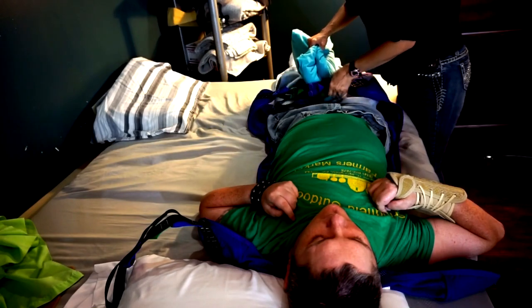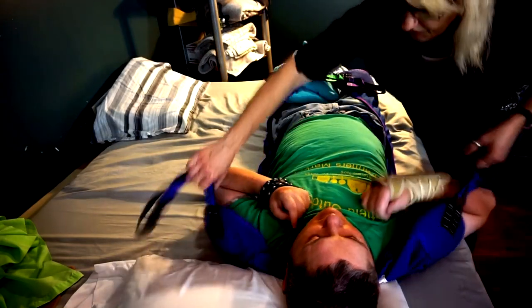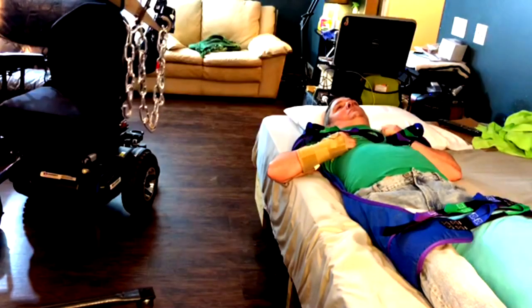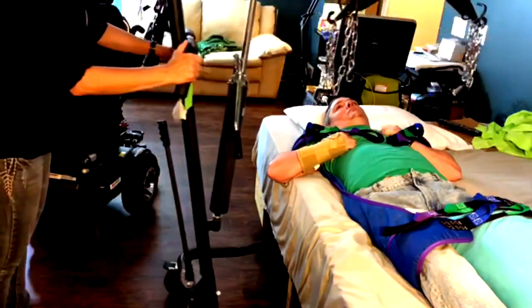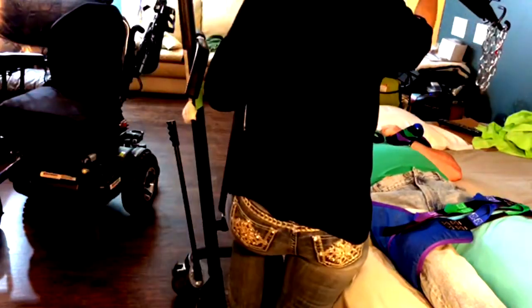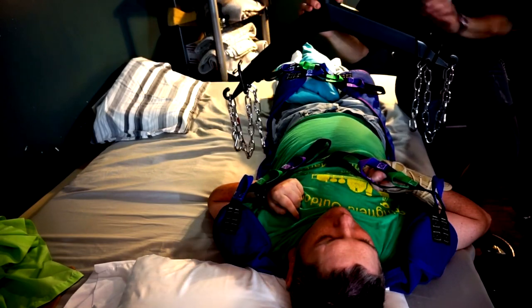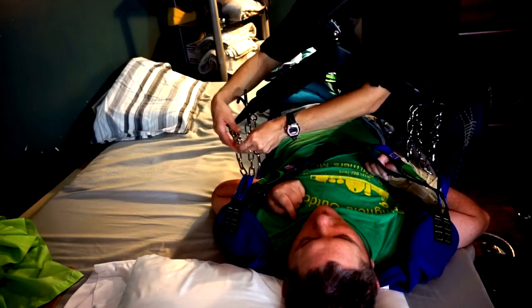Then I put a pillow between my knees so that way nothing gets crunch smashed or crushed. Then I bring the Hoyer over top of me, I put it around my belly area, and I lock the wheels — I don't want it rolling away as I'm lifting myself up in the air.